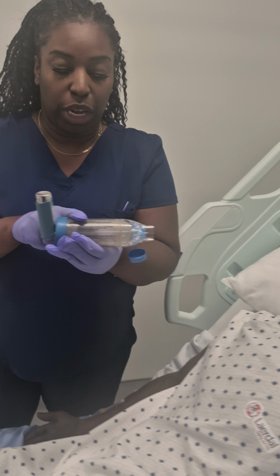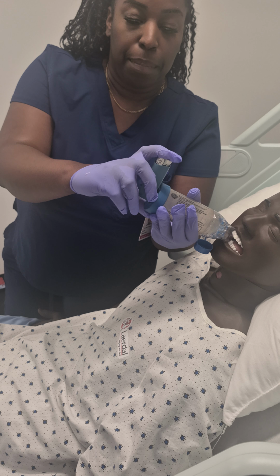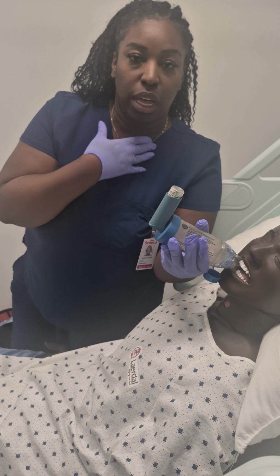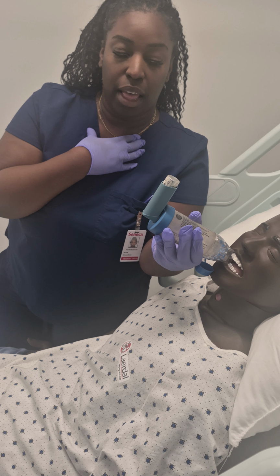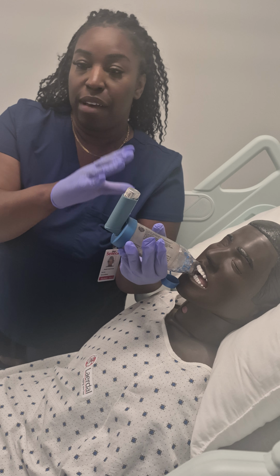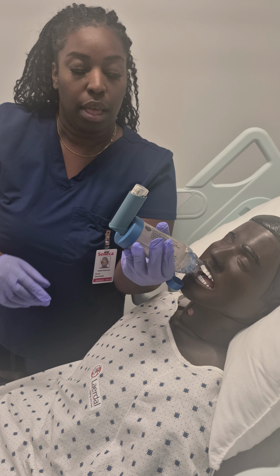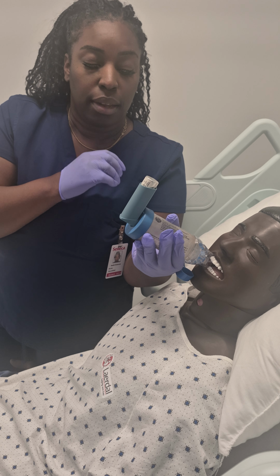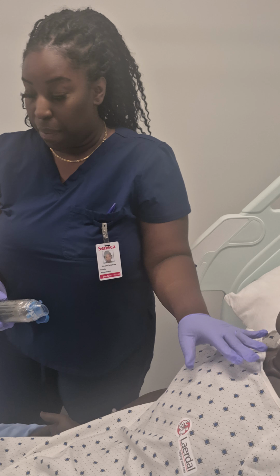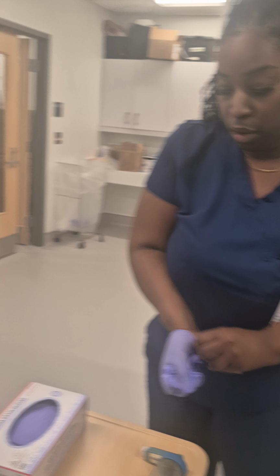I've inserted it into the chamber. I'm going to advise the patient to clench down with his lips to create a tight seal. I'm going to apply the first puff. In between each puff, I'm going to let the patient know to keep a tight seal, inhale, and breathe through his mouth. And then I'm going to do another puff after 30 to 60 seconds, and then apply another puff. And repeat again, tight seal, and also inhale through the mouth. Once completed, keep the patient in an upright position and document the medication administration.